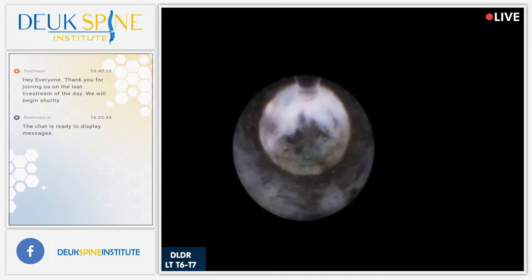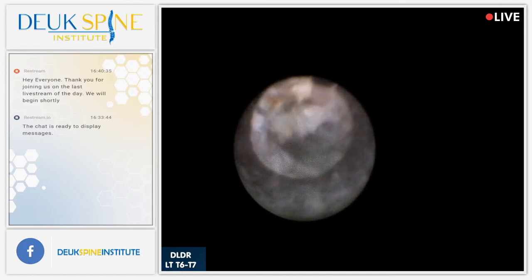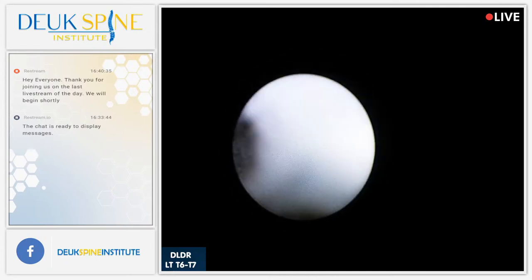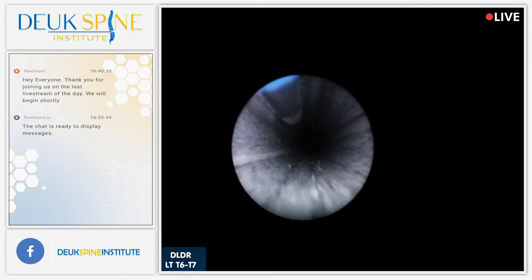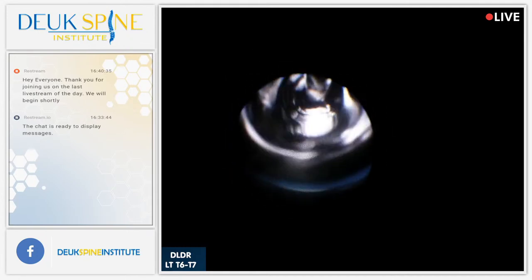Got just a few minutes left on this. You can see how quick and nice the surgery is. It doesn't require removing the rib. It doesn't require major surgery. It doesn't require fusion. It doesn't require metal or biologics at this time. There's nothing. Just natural surgery.